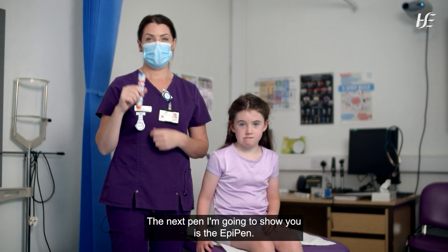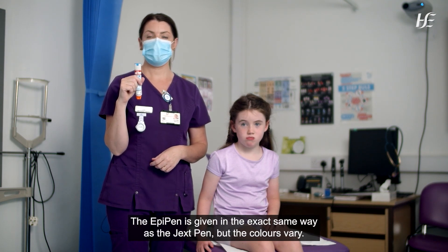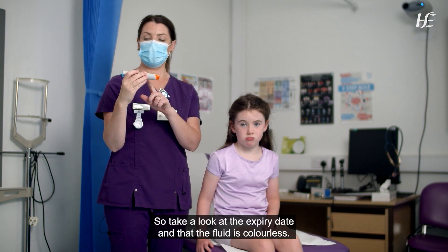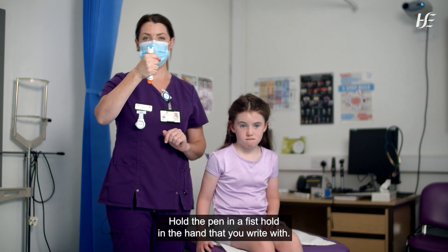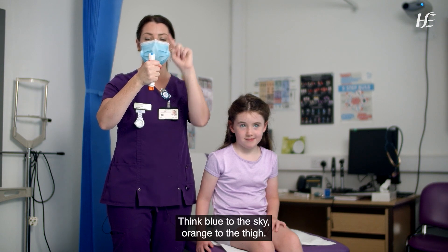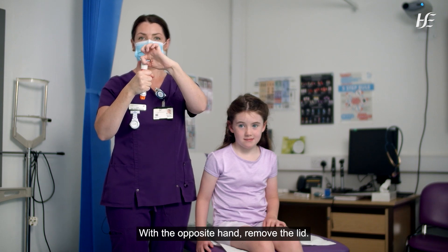The next pen is the Epi Pen. The Epi Pen is given in the exact same way as the Jext pen but the colours vary. Take a look at the expiry date and ensure the fluid is colourless. Hold the pen in a fist hold in the hand that you write with. Think: blue to the sky, orange to the thigh. With the opposite hand, remove the lid.